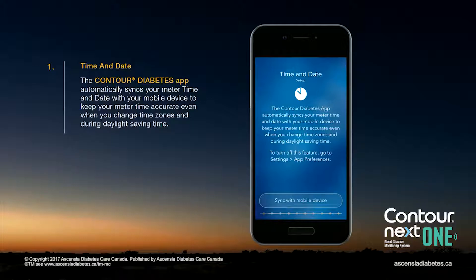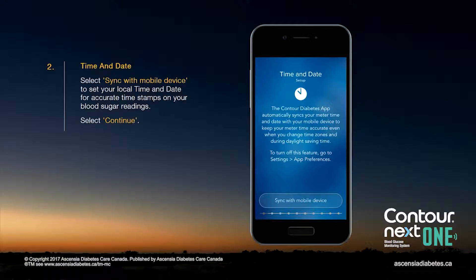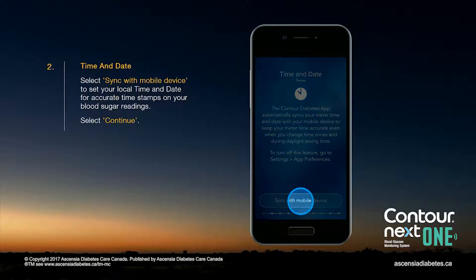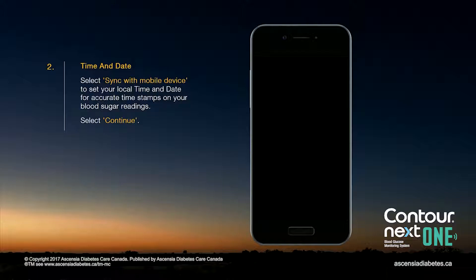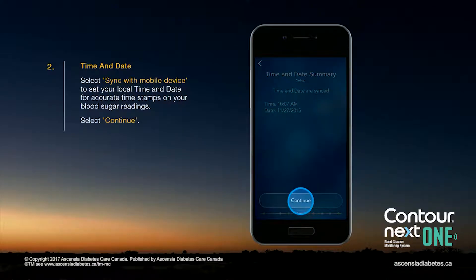The Contour Diabetes app automatically syncs your meter time and date with your mobile device to keep your meter time accurate. Select Sync with Mobile Device to set your local time and date for accurate timestamps on your blood sugar readings. Then select Continue.